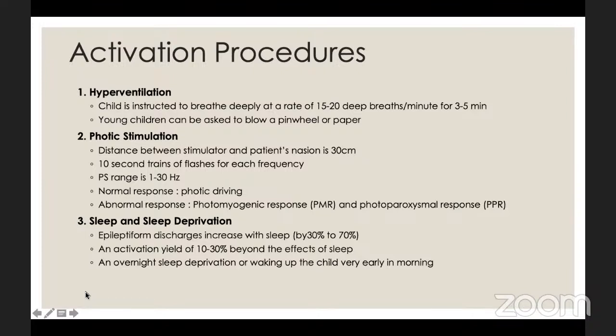Ten-second trains of flashes for each frequency are used. The photic stimulation range starts from 1 Hertz and goes up to 30 Hertz. The normal response is photic driving, and the abnormal responses are the photomyogenic response and the photoparoxysmal response. I think they'll be covered in subsequent talks. And then sleep and sleep deprivation EEG.